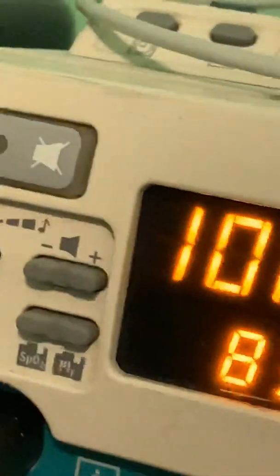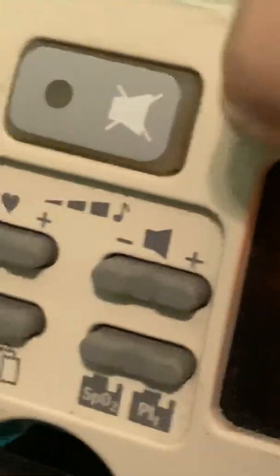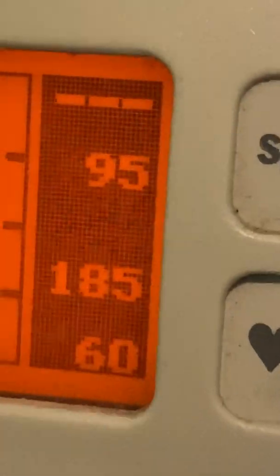This right here is the on and off button. This is where the cable connects — the sensor — and this is the alarm silence button. I just pressed that, and somewhere along here there should be a bell icon to show you that the alarm is silenced.